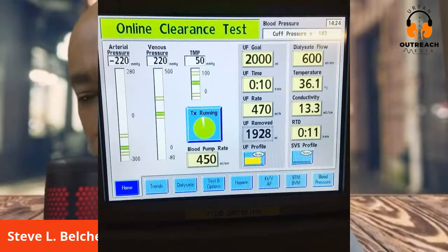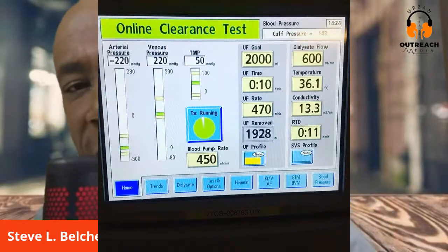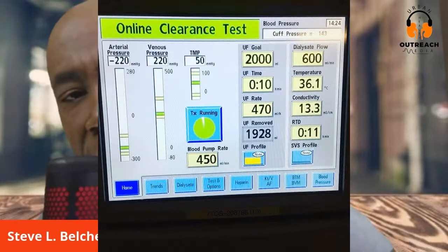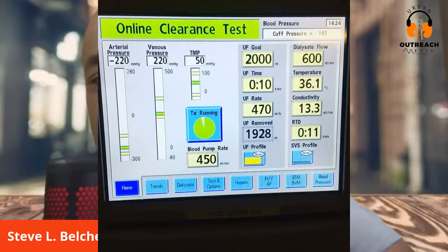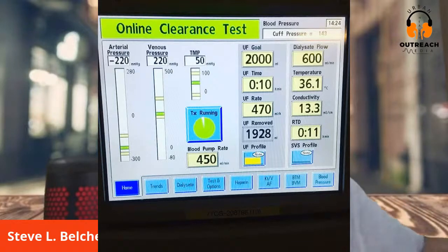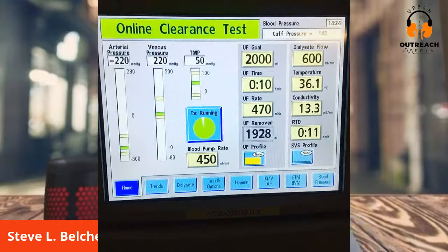And also, if the machine stops, the UF time stops and the RTD keeps going. Each time your machine stops and they reset it, the longer it stops, the longer it prolongs your treatment. The longer your machine stops or the conductivity drops, it prolongs your treatment because the machine recalibrates so it can take off that fluid in the amount of time it's supposed to take off.